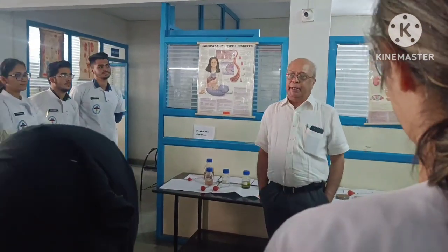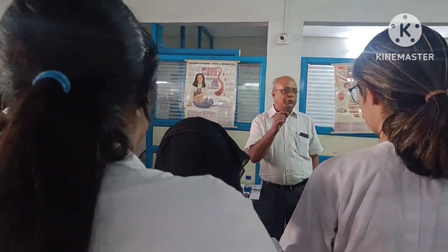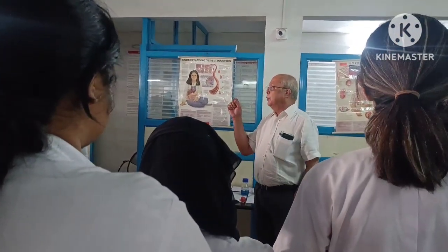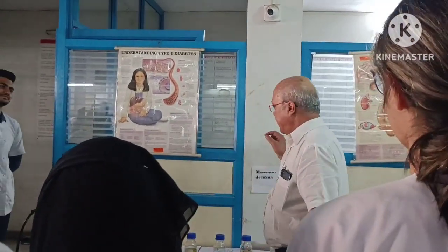Generally, this is the method that is used to perform tests to detect glucose in urine in most of the labs. There are some rapid tests which are done on the urine to detect glucose and proteins, which are done by using strips, which are known as dipsticks. Dipstick uses the glucose oxidase method. It is specific for glucose, whereas the Benedict test that we do is not specific for glucose.